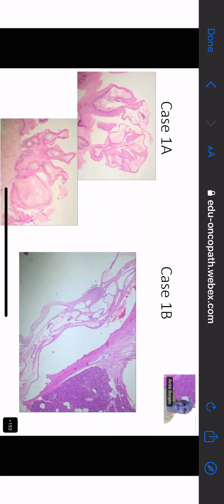Do you think that this lesion that is exophytic, and it definitely is exophytic? Do you agree, Dia, that this is exophytic? Yes, ma'am. Very good. So, this exophytic lesion is the result of the epithelium, which in this case is squamous epithelium of the tongue. Isn't that right? Yes, ma'am. Right.